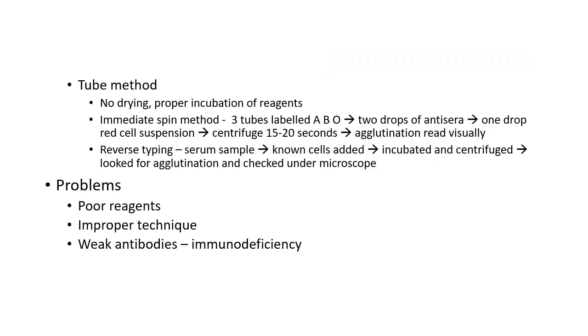Another method used is the tube method. It has a few advantages. It does not allow the drying of the sample and ensures proper incubation of the reagents. There are two different forms of tube testing. One is the immediate spin technique.